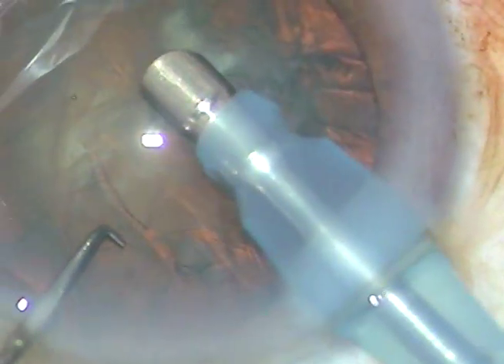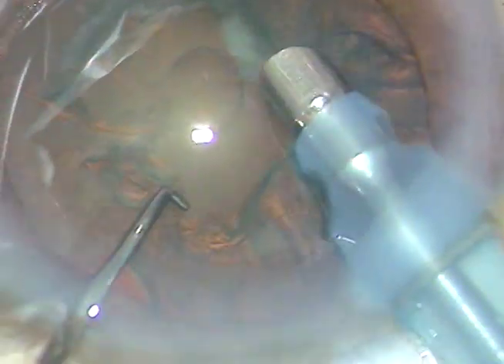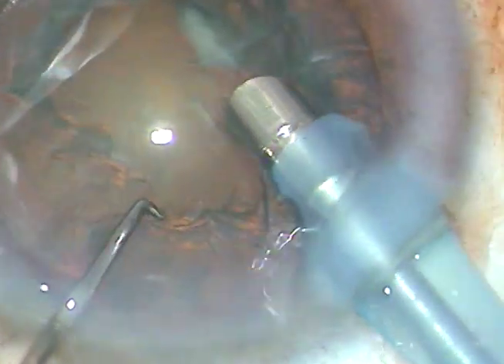The tip of the phaco handpiece is introduced. Some superficial cortical lens matter is aspirated for better visibility. Now aspirate some cortical matter, and this will improve visibility.